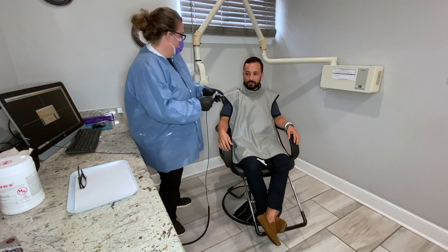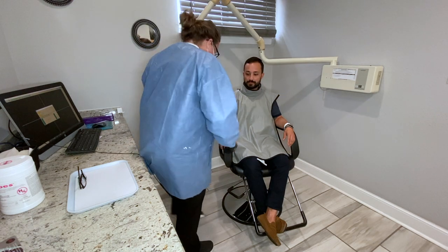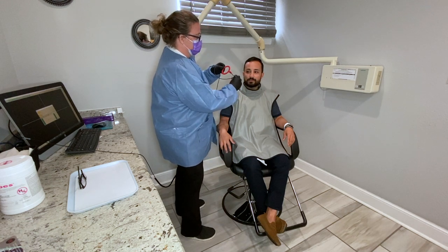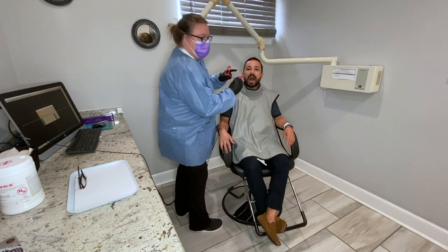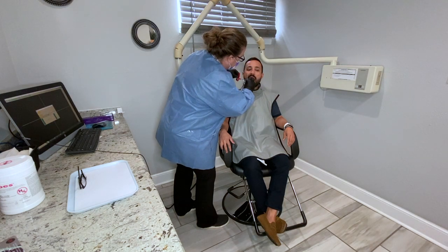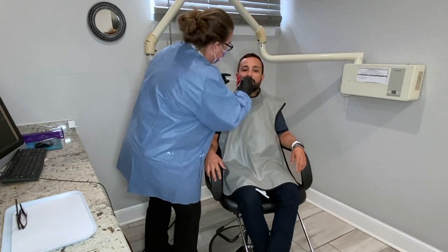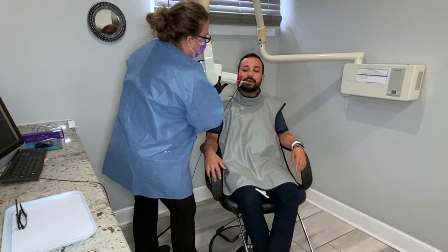We're going to place our bite wings — get on the opposite side of our sensor wire, pull it out, and make sure our sensor is in the middle and covered. Open for me. We're going to go back and make sure we get the distal of his last molar so we can see it. Place it straight in and gently bite. Place the head of the x-ray unit nice and parallel, nice and straight.